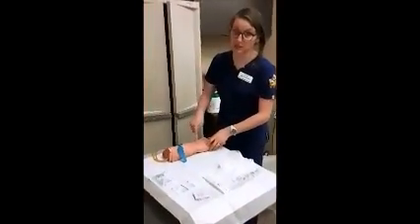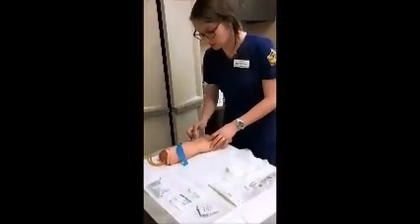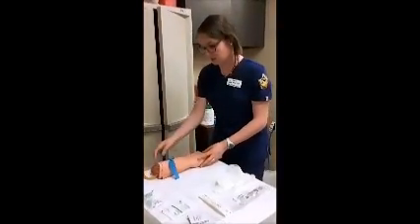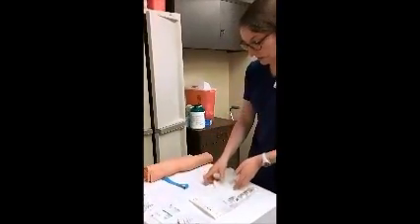Make sure you're not going into a tendon. Tendons will feel very hard. Veins are nice and bouncy. So we've established that there's a great IV site there. His skin integrity around that area is phenomenal. So we'll loosen our tourniquet, because we don't want him to sit there tied up. It's not very comfortable. And we'll get our supplies ready.